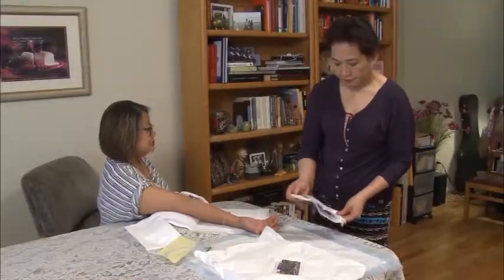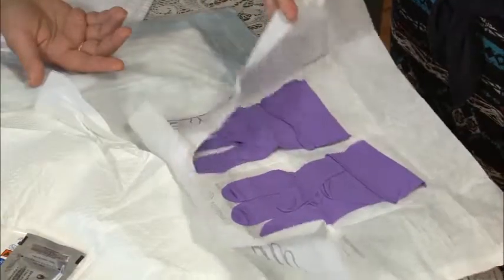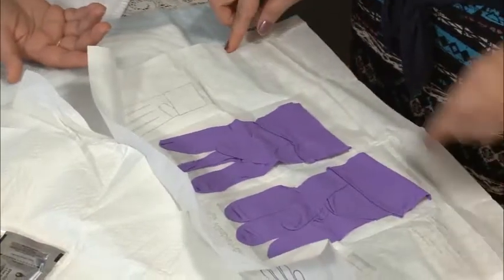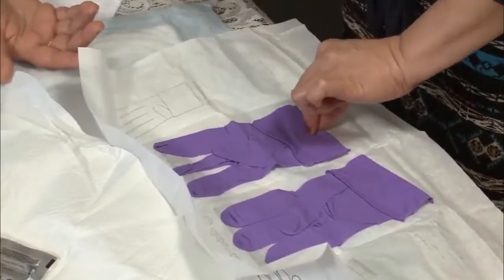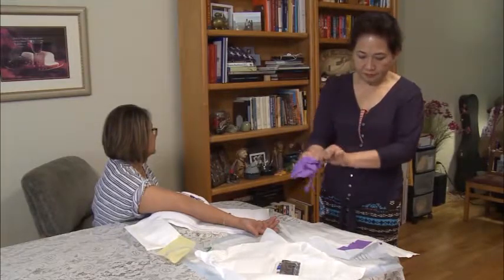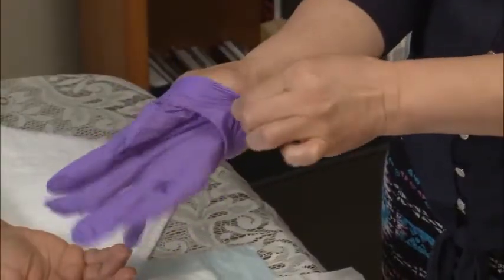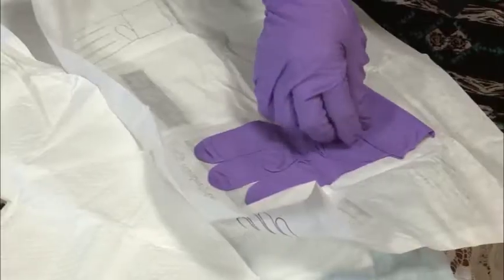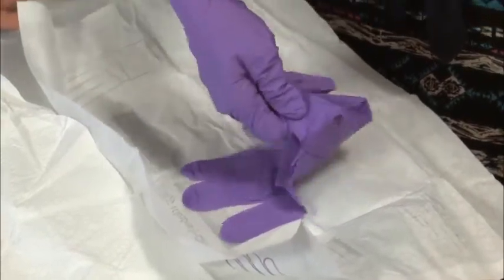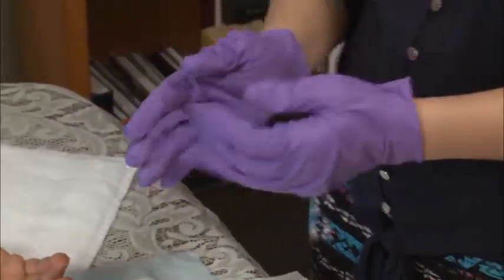Open the sterile glove package. The gloves are packaged with the inside cuff turned out. Pick up the folded edge of the glove. Keep it sterile. Don't touch it except for the folded cuff. Lift it clear of the table and hold it away from your chest. Insert your dominant hand into the glove. Next, with the sterile gloved hand, slip your fingers under the cuff of the second glove and slip your other hand into the glove. Now you have both sterile gloves on.